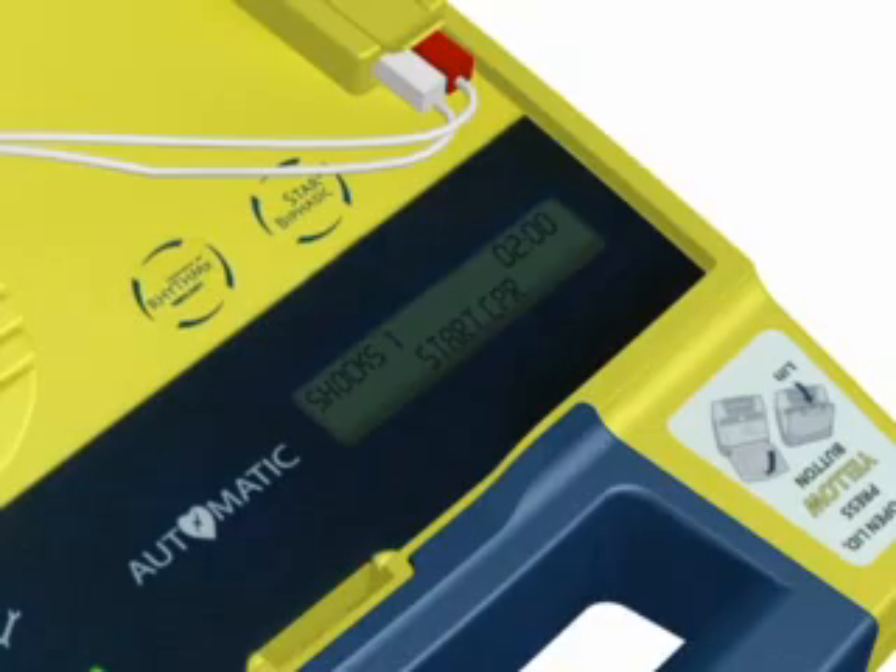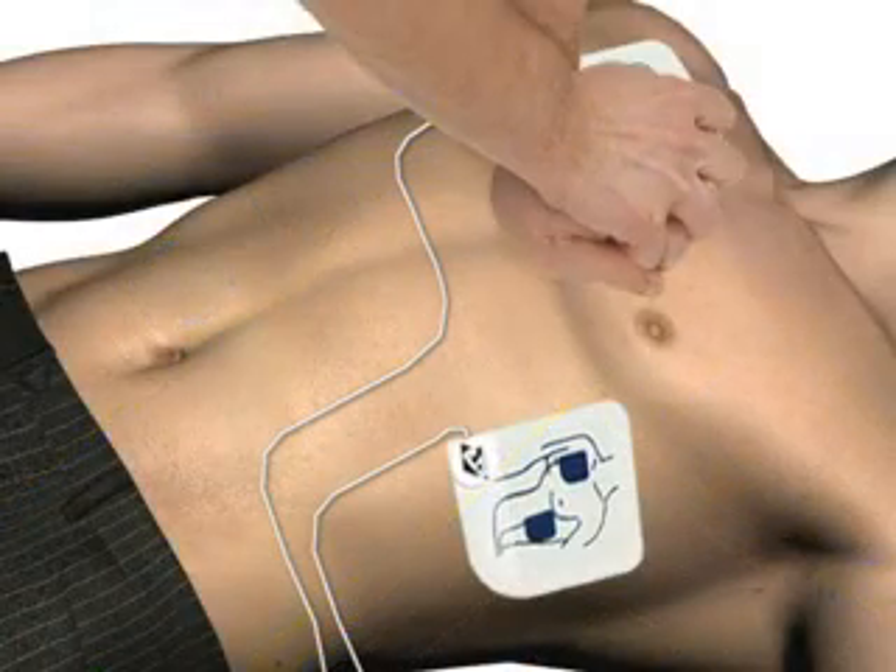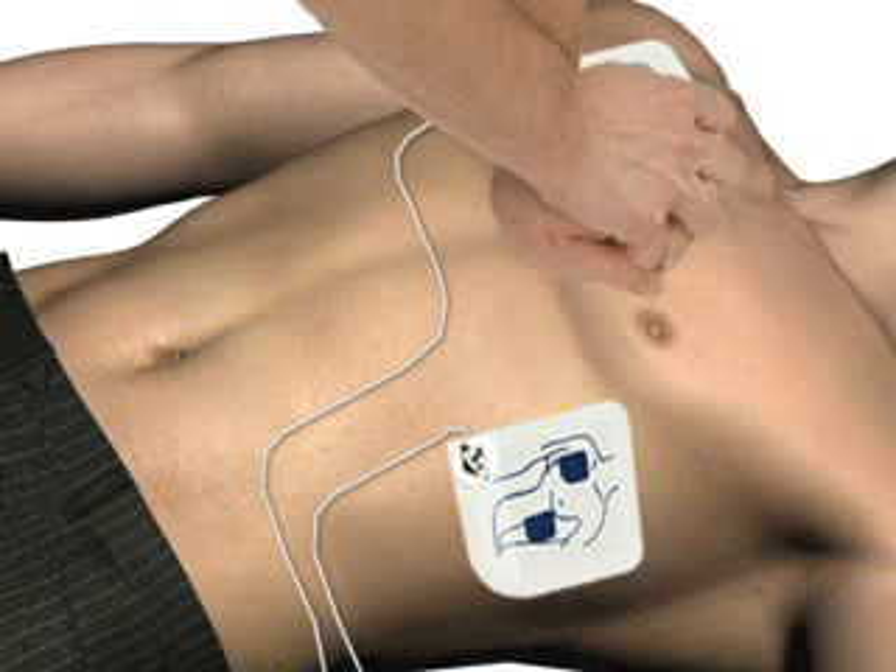Start CPR. Press. Press. Press. Press. Press. Press. Press. Press. Press. Press.